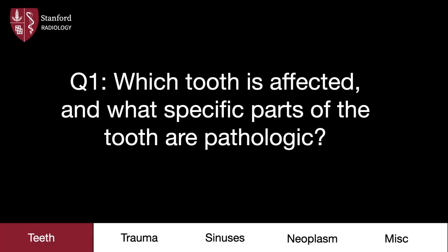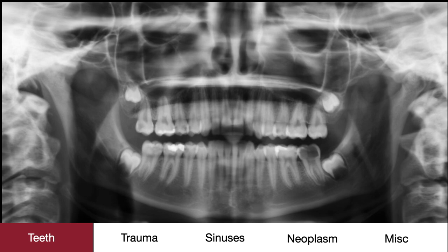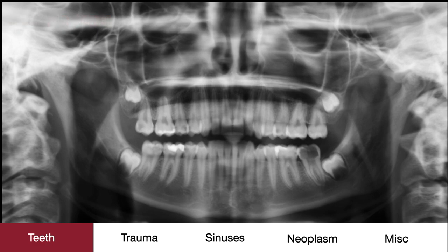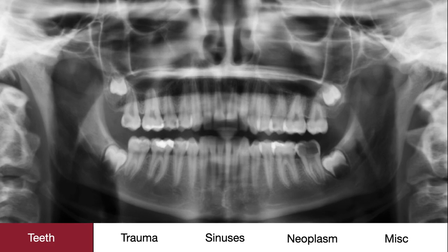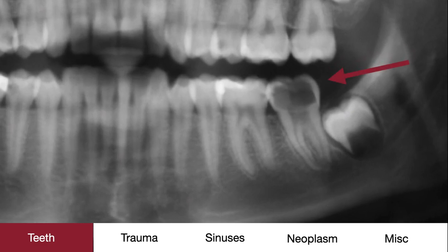Our first category is teeth. In our first case, which tooth is affected and what specific parts of that tooth are pathologic? If we do our tooth search pattern, we notice that the maxillary row of teeth look okay, but the left second mandibular molar looks different than the rest. More specifically, there's lucency involving the enamel and dentin, with extension to the pulp chamber.